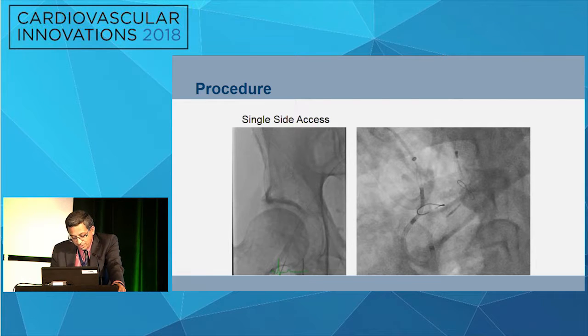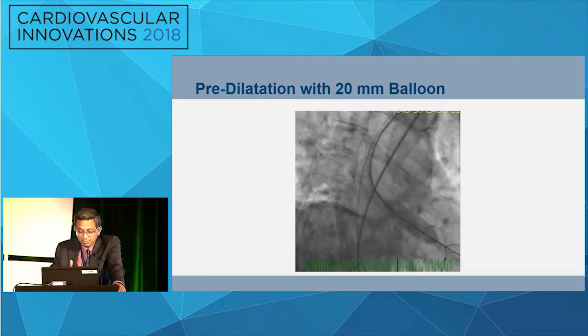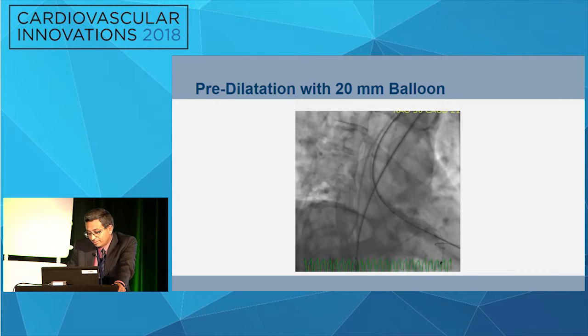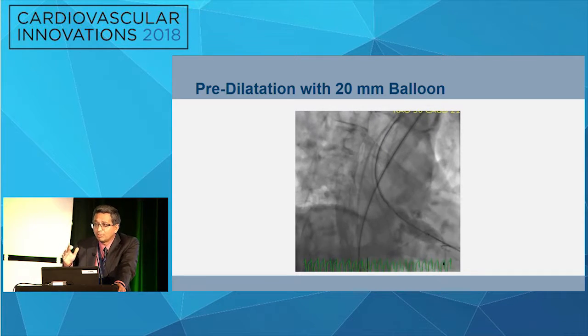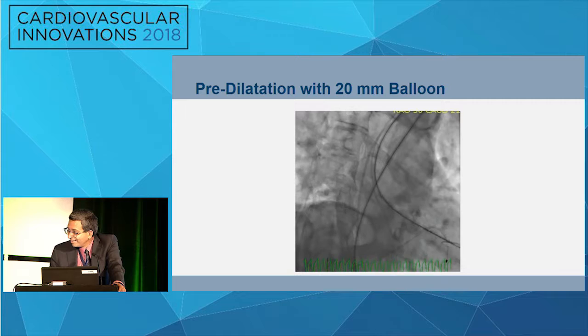So here, this is our standard. We do the same access. I put an arterial sheath, and underneath that there is another arterial sheath. We put a sentinel device, calcified valve, conscious sedation. I don't use predilation, but this valve is coming at an angle and it is super calcified. When we crossed the valve, we had a 100 millimeter gradient. I said, let us not try to cross directly, let us just dilate it. This is unusual for us because we would not have dilated, but while we were working, I felt that maybe we should dilate. I think with a bicuspid horizontal root, we do that too.